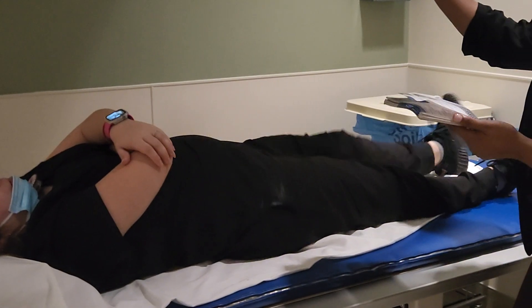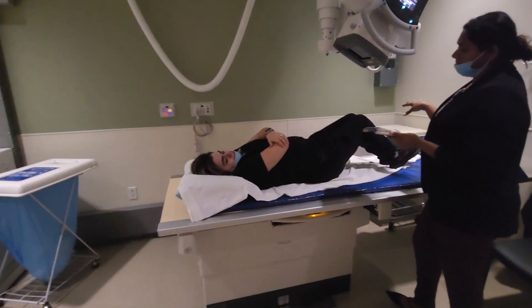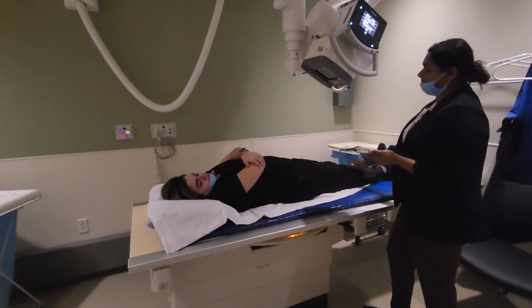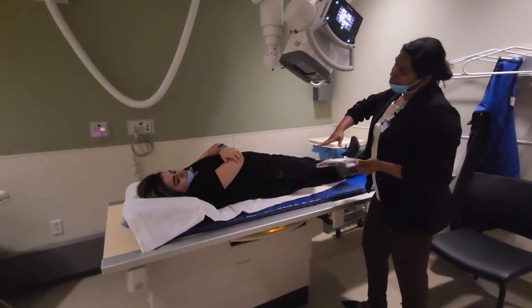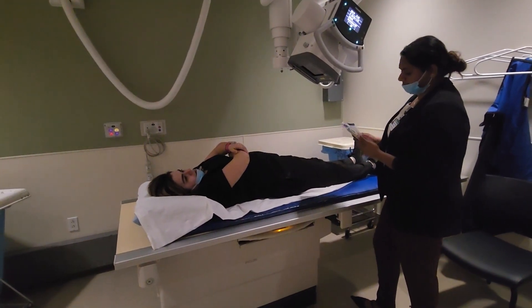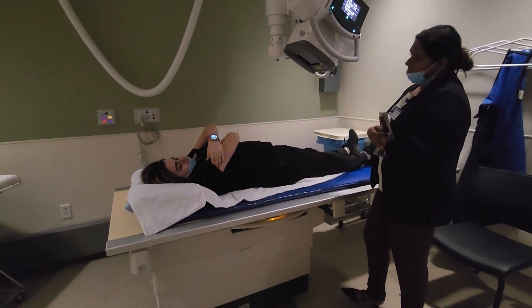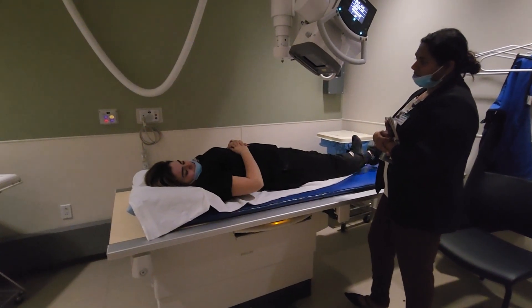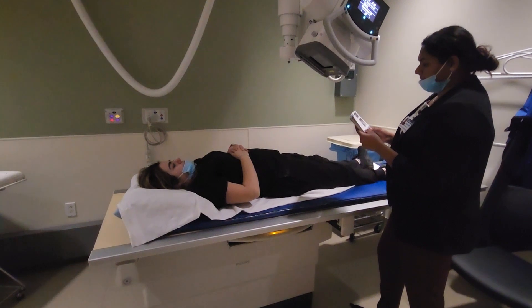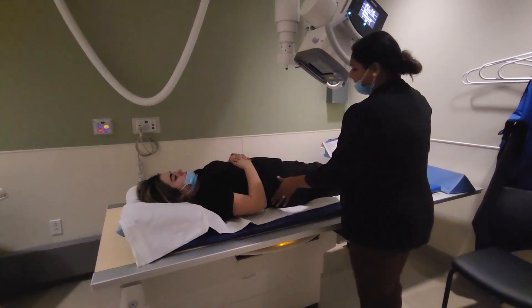For AP lumbar, I thought we had to do this — you can leave the legs straight in clinic, but for test-style purposes, they say that leaving the knees bent makes the back more flat and touching the IR, so you can choose to do that if you prefer. Some techs may have their knees bent, but it's rarely done. For oblique SI joints, we're going to oblique the patient about 30 degrees, which is less than our lumbar.